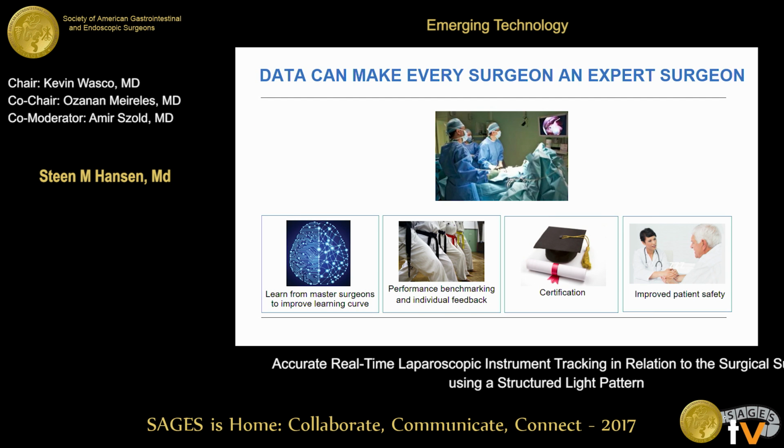So the way we want to use this data is that we want to learn from master surgeons and learn what are their moving patterns and make that data available to younger or more unroutine surgeons. So what you can do is make a performance benchmarking of each surgeon. In that way, we are able to provide individual feedback. Let's say you're a young physician, and you have some movements that are not optimal. Well, we will be able to tell that to each surgeon each time they operate when correlating these data with information from experienced surgeons. That can lead to new certification helpful for the surgeon himself.